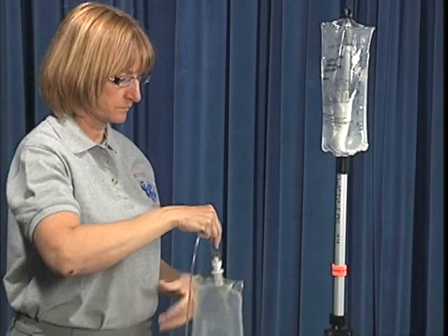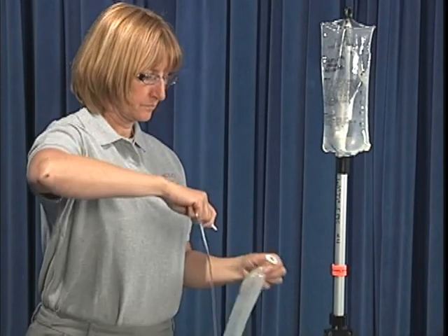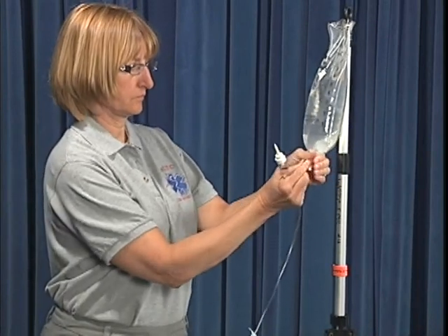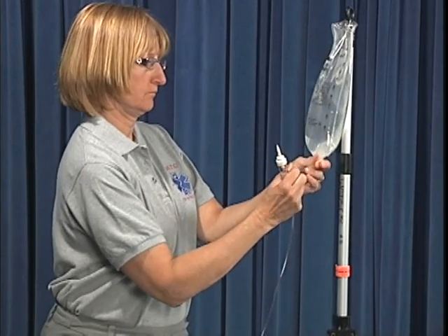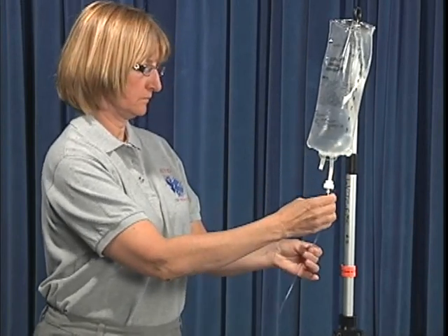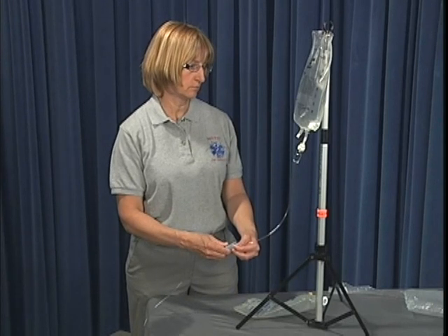Invert the empty bag to prevent any remaining fluid from running out, then remove the IV tubing spike from the bag using extreme care to ensure the spike does not touch anything and contaminate the sterile field. Follow the methods previously described to puncture the new solution bag. Discard the used solution bag after noting the approximate amount of fluid remaining, if any. Finally, re-establish the IV flow rate.